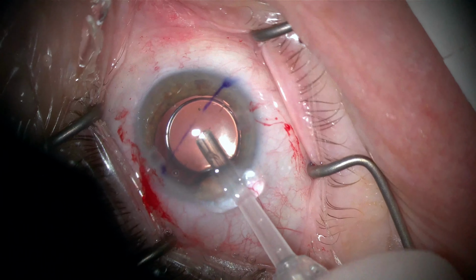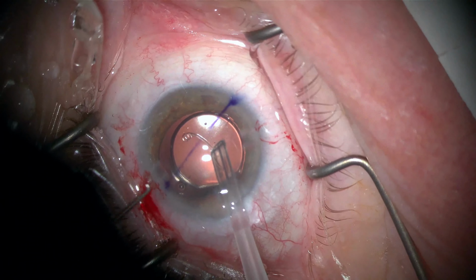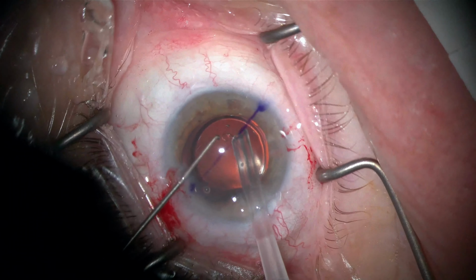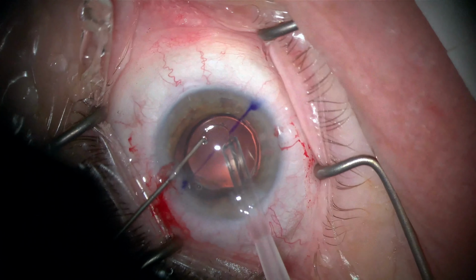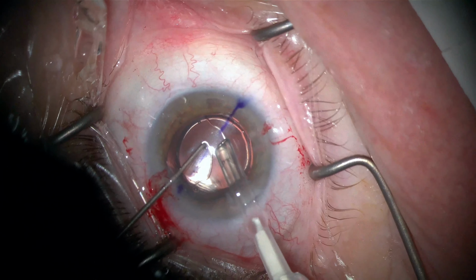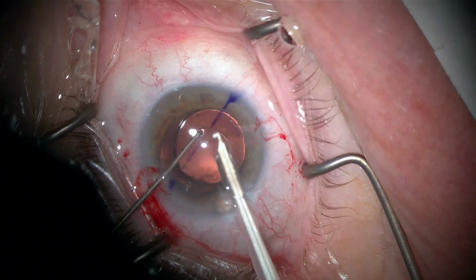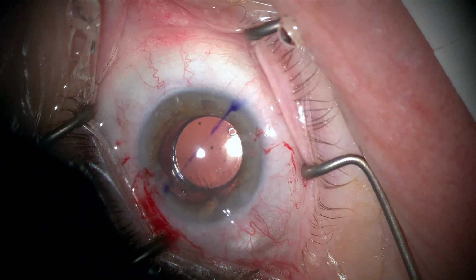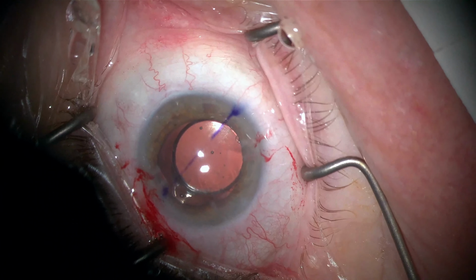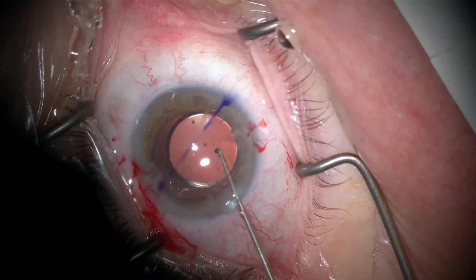So I decided to use a capsular tension ring in this case, and here I'm using the Henderson style scalloped capsular tension ring, which in my experience, when you use it for these cases, helps provide better stability of the IOL, probably by making more contact with the haptics in the capsular bag. And I'm using a Sinskey hook here in my non-dominant hand to make sure that the leading end of the CTR does not further move the IOL out of position.